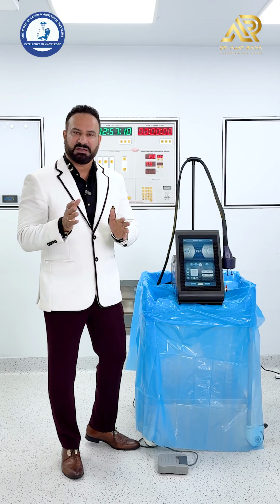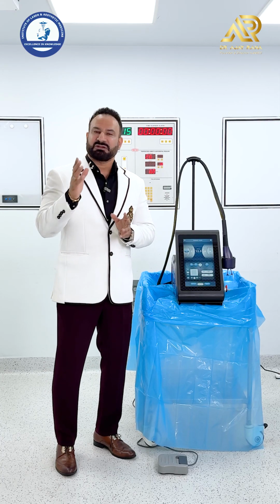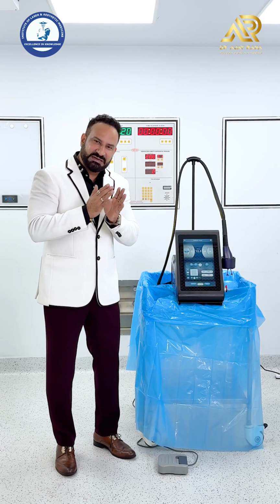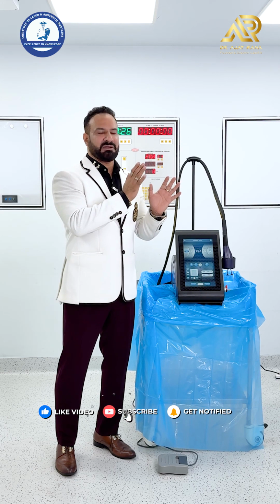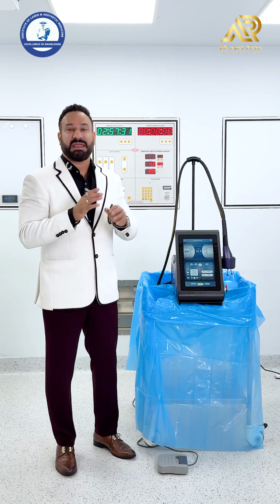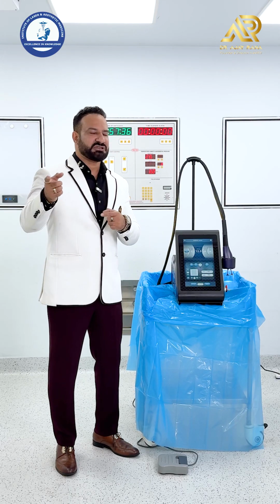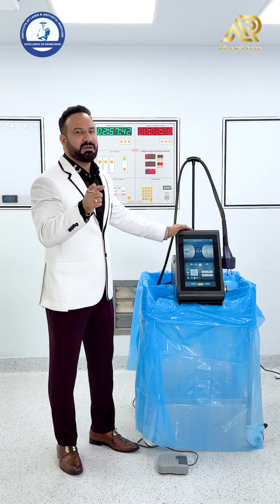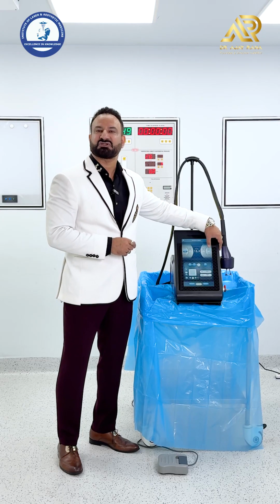Let me tell you where pulse widths in fractional lasers are different from technologies like diode lasers. In diode lasers, when you do hair reduction, if you increase the pulse width, you become gentler because you are delivering energy over a longer period of time. While pulse width in fractional platforms actually means exposure time. So if your pulse width is longer, this is just the opposite of a diode laser. You are burning longer in this platform, so you are more aggressive. Alright, then there is another parameter here, which is overlap.